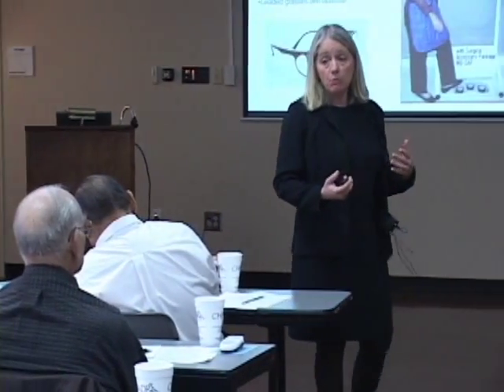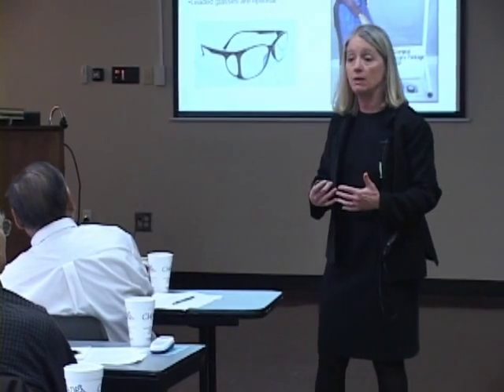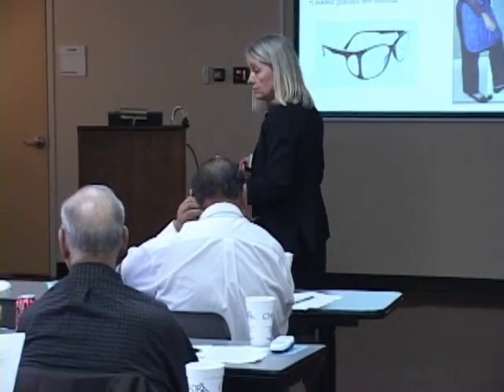If you take a spacer off for any reason, you can get a variance. Let's say you're doing a cross-table lateral hip and it keeps contaminating the field or something like that. You can get a variance from the Department of Health Services to remove that spacer, which is for patient protection, but within 20 minutes of the procedure being completed, that spacer has to be back on the unit. And that's a foot or 20? It is 30 centimeters or 12 inches. It guarantees a distance from the X-ray tube to the patient of 12 inches or 30 centimeters, actually from the port, the opening of the X-ray tube housing.